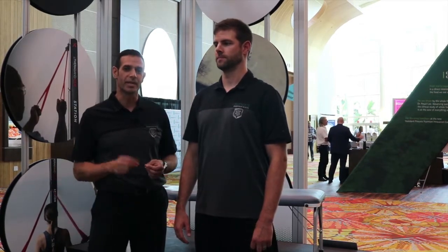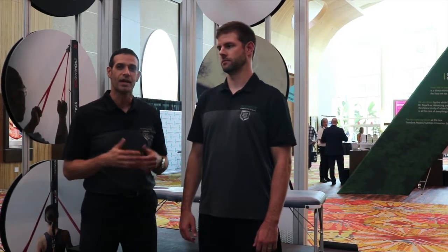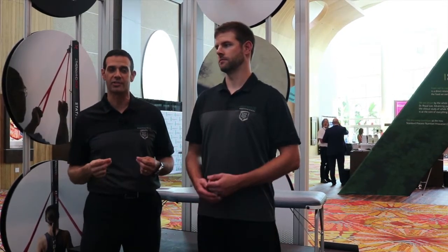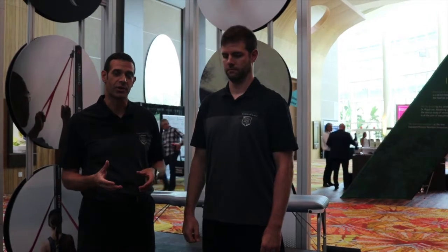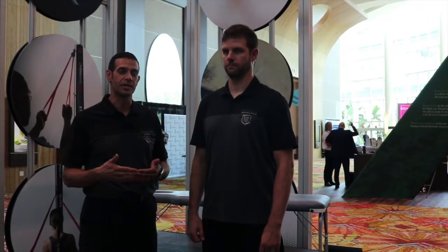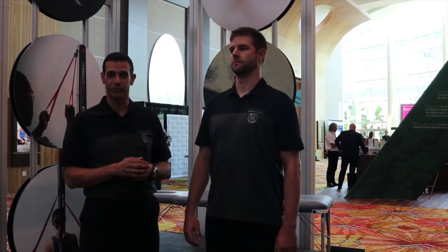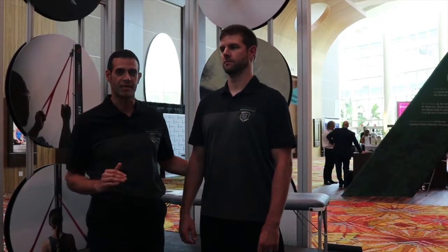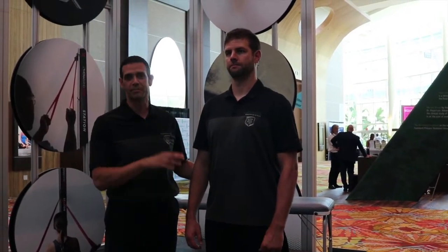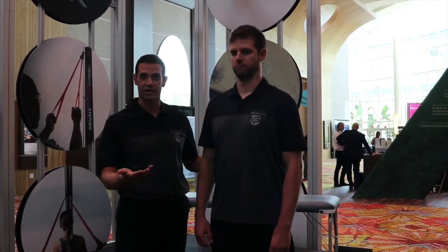Now, an easy way of determining which way we actually want to tape the person, using a straight kinesiology taping technique versus using some leukotape with kinesiology tape and a tab-oriented tape job, which we'll explain in a second, is largely about the evaluation procedure. If we're just going to be using kinesiotape on somebody, the patient can tell us, I have pain going into lumbar flexion. And the easiest way of determining whether a straight kinesiology taping technique is going to be most effective is simply by doing a soft tissue procedure associated with his movement pain.